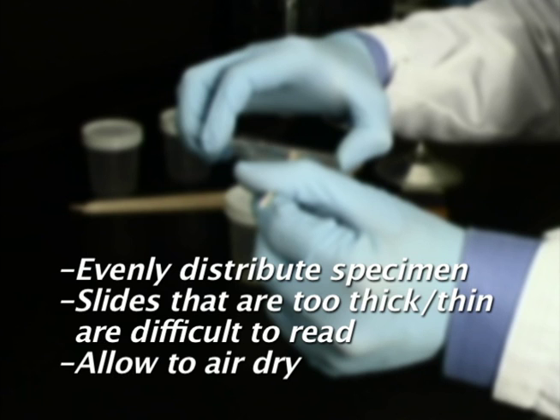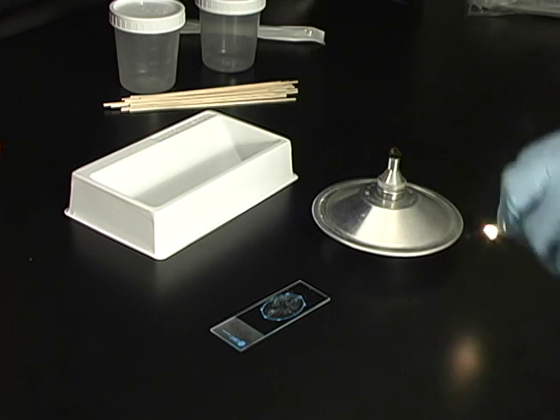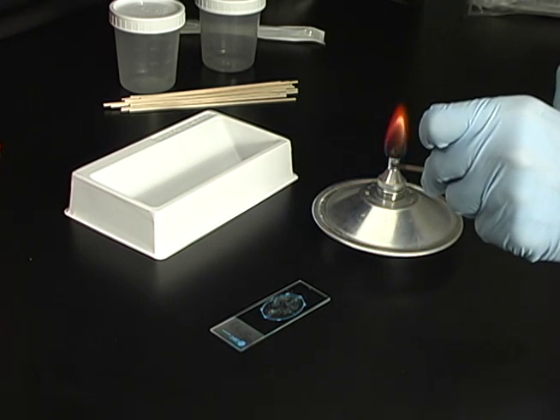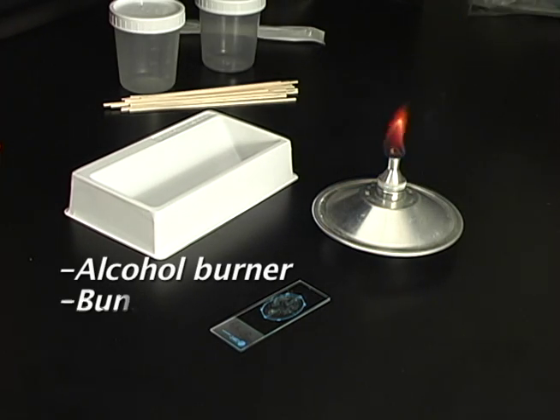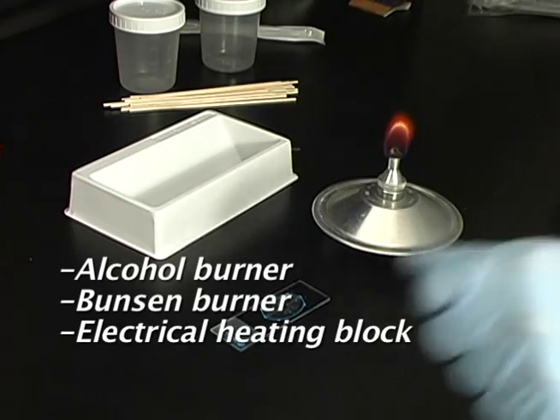Allow the slide to air dry. Once the specimen has dried on the slide, heat fix the slide using an alcohol burner, Bunsen burner, or electrical heating block.